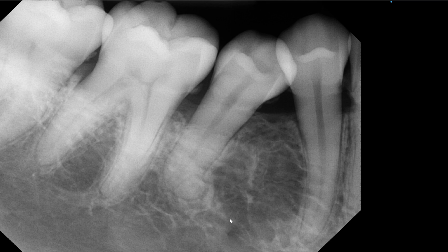You also need to evaluate what it's doing to the surrounding structures, so pay close attention to the lamina dura and the PDL space of both 28 and 29. If you think there is a lesion, maybe that explains the distally displaced appearance, or the mesial tipping of the crown of 29. If you don't think there's a lesion, what could potentially be an explanation for this appearance?